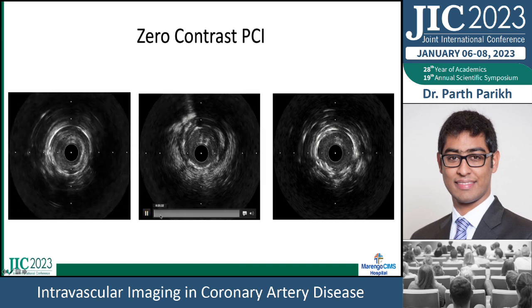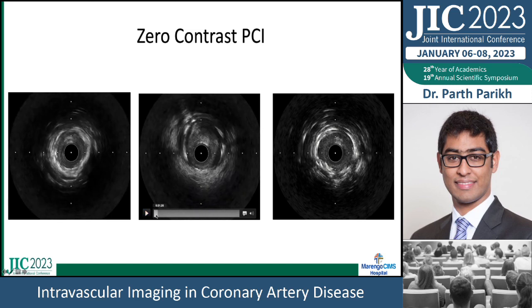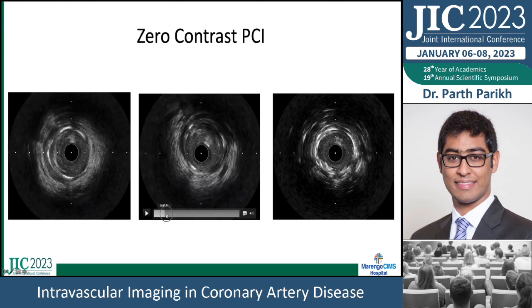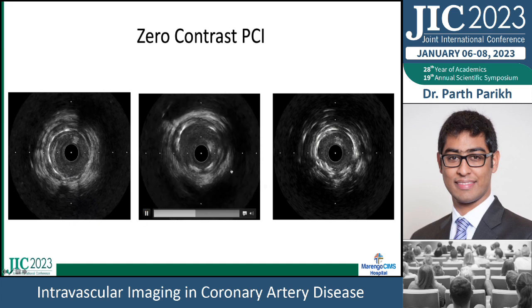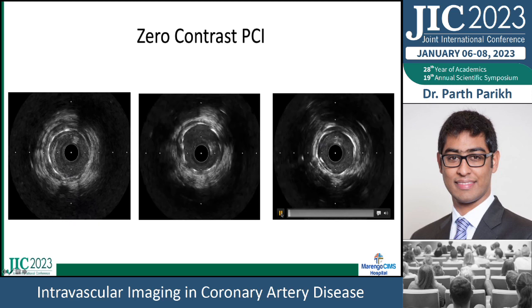So we placed a new stent. We just used IVUS imaging. Again, absolutely zero contrast, not even a single shot to visualize for the PCI itself. And if we keep playing this, you will see that we get a really good result with the stent, with a good MSA as well.